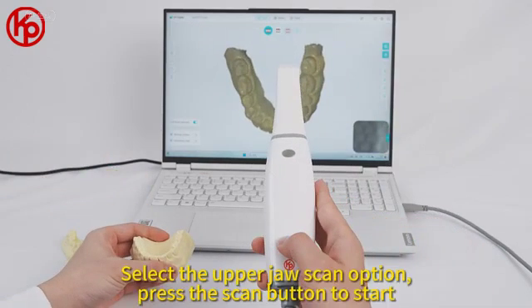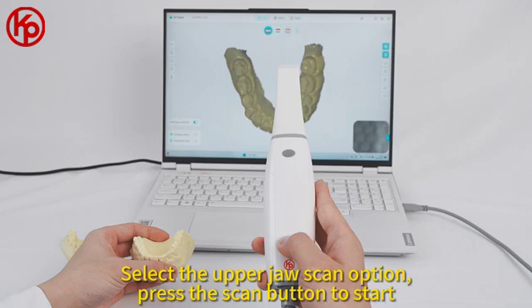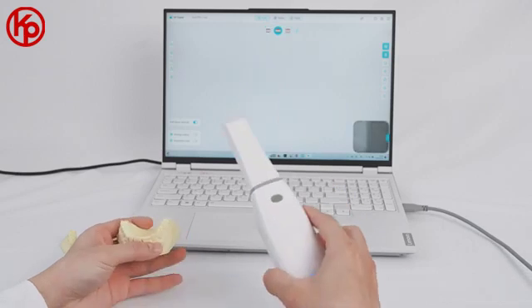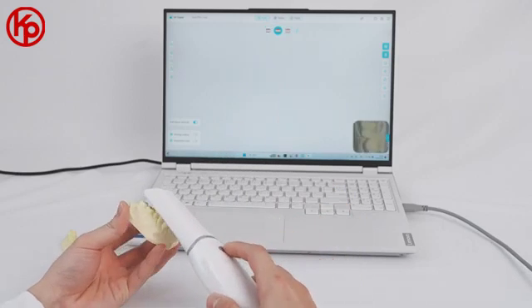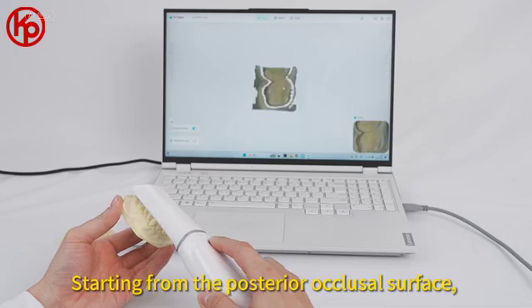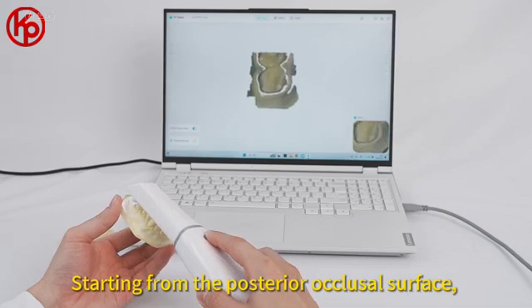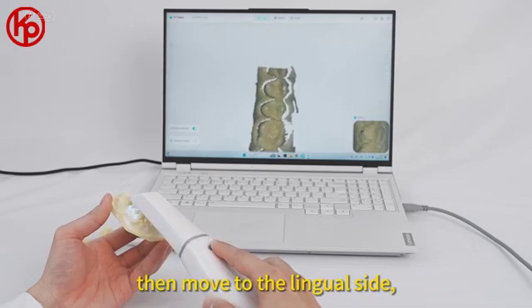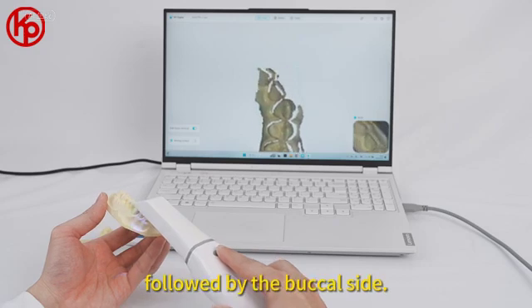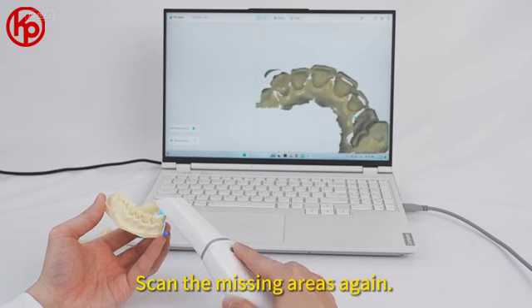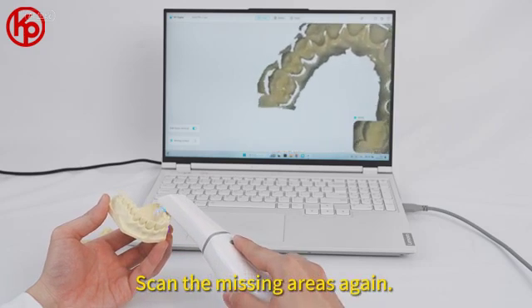Select the upper jaw scan option and press the scan button to start. Starting from the posterior occlusal surface, then move to the lingual side, followed by the buccal side. Scan the missing areas again.